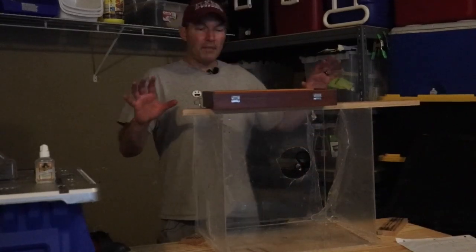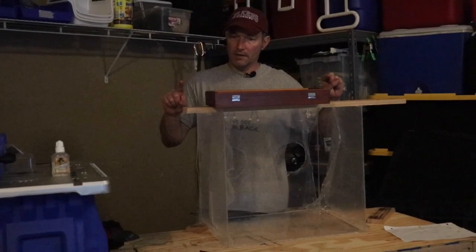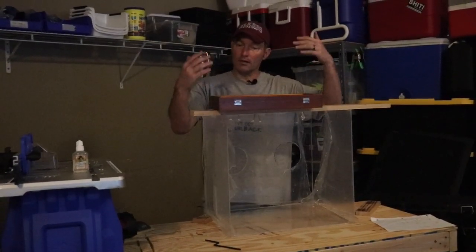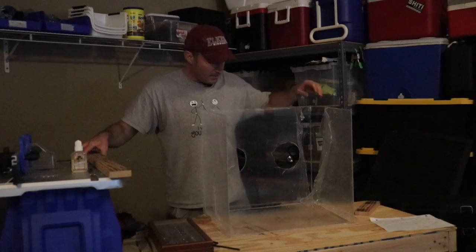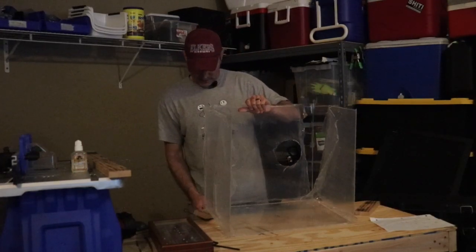All right, so it's been about 2 hours now since we're using that glue. Like I said, we used Gorilla Glue instead of the acrylic cement. It took a little longer than expected, so it's getting a little darker. The light's not as great. We had to kind of jerry-rig to help hold everything in place. Let's move everything out and see how we're doing here. You can kind of sort of see how it's going to go.